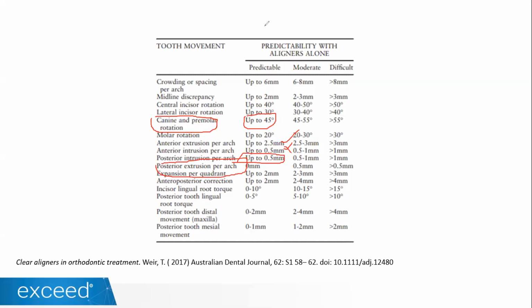We need to take into consideration that in our patients, this is not just like regular braces. We have a material in there between the upper and lower arch. This means that the patient is biting into this surface of the aligners. Let's imagine you are using an occlusal bite plane in a child. When you remove that occlusal bite plane, you always see intrusion of those posterior teeth. You see that those posterior teeth are not touching very well. This is because the patient is only biting in that posterior region. This is the same thing that happens with aligners.